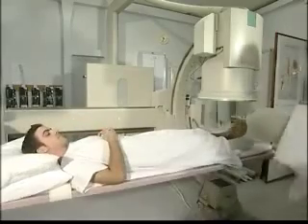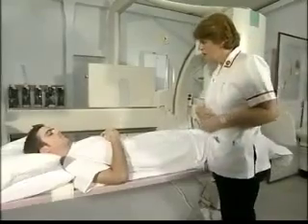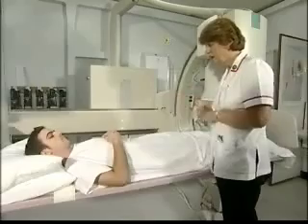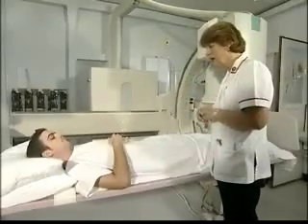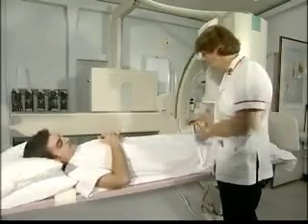So what we'll do is the doctor will pop a needle into your artery and put the little tube up, and then we'll inject some x-ray dye with a warm feeling as the dye goes down your legs, and we'll take pictures of all that's happening. All you have to do is lie there, and we'll tell you what's going on as we go along.